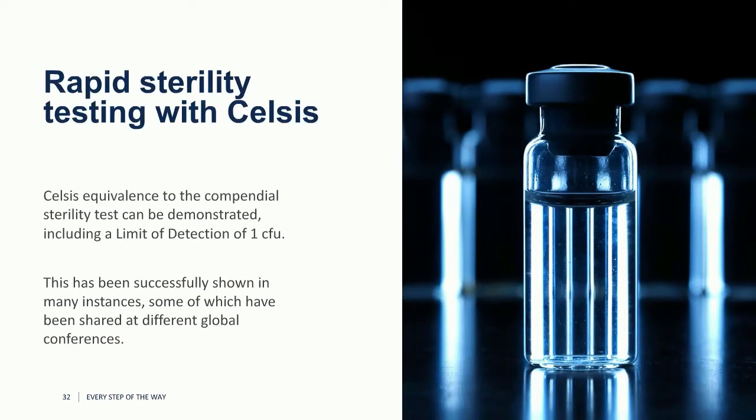So I wanted to touch a little bit on Celsis today. Celsis is a technology that's often referred to in the literature as an enhanced or amplified ATP bioluminescence. When I use Celsis, I'm talking about the Charles River platform particularly. I wanted to show that Celsis can actually be used in both ways.